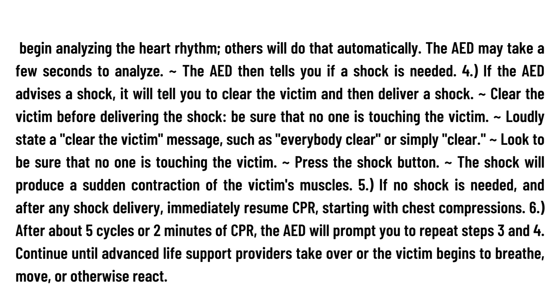Step 4: If the AED advises a shock, it will tell you to clear the victim and then deliver a shock. Before delivering the shock, be sure that no one is touching the victim. Loudly state a clear message such as 'everybody clear' or simply 'clear,' and look to confirm no one is touching the victim.